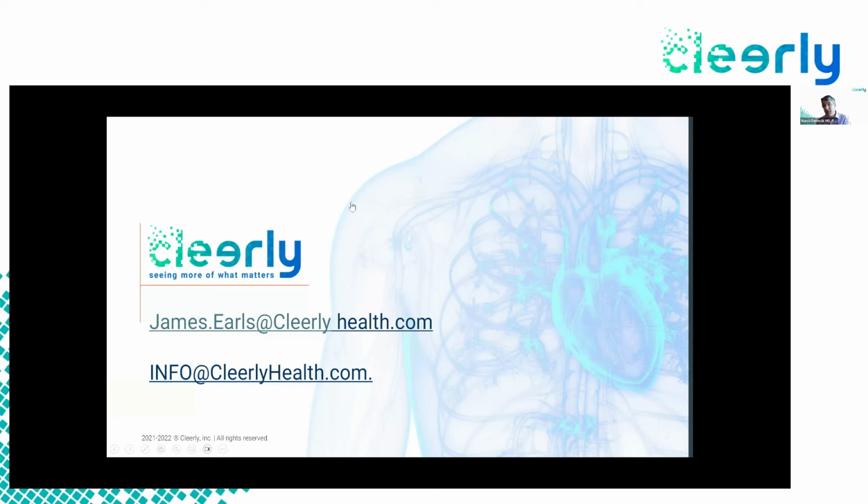You have these data from the performance in clinical practice, where in some it was similar, in some AI-QCT was better. I think ultimately you would need a prospective study. All these results are dependent on how you measure FFRCT. You can go to the details of the specific trials. The invasive FFR was measured in one study in the distal vessel, and in another study just distal to the lesion. It depends how you measure invasive FFR. It will affect what your diagnostic accuracy of these tests will be.